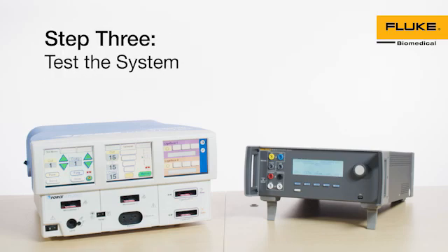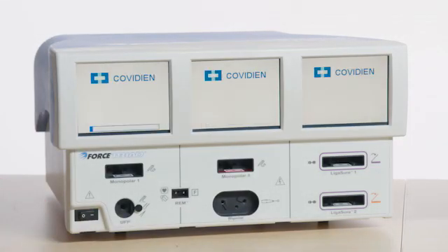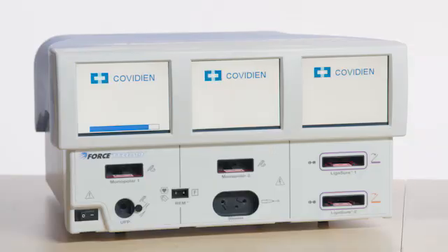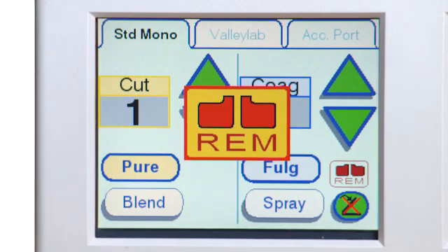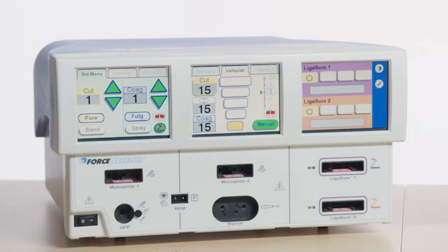Step 3: Test the system. Turn on the Force Triad and verify all visual indicators and displays on the front panel illuminate and an activation tone sounds. If the self-test is successful, a tone sounds. Verify the following: the three LCD touch screens turn on and show the appropriate operating screen.